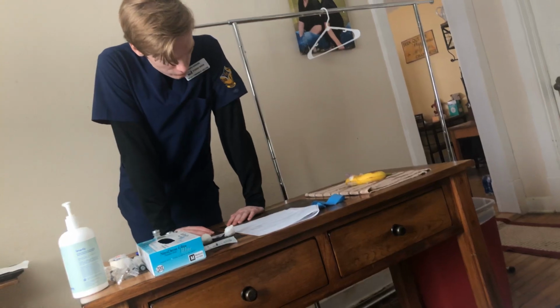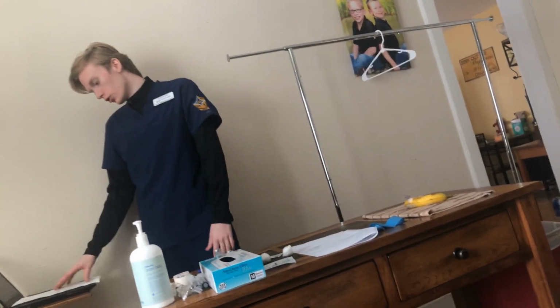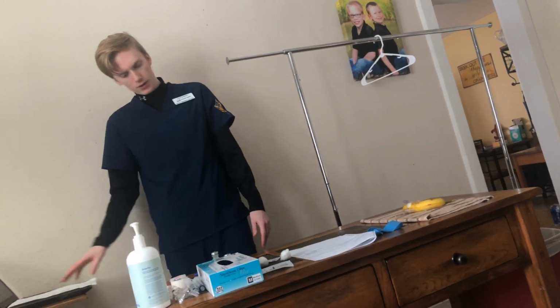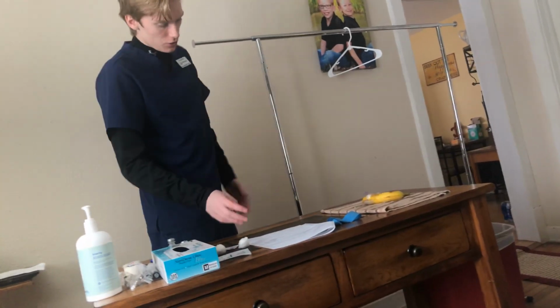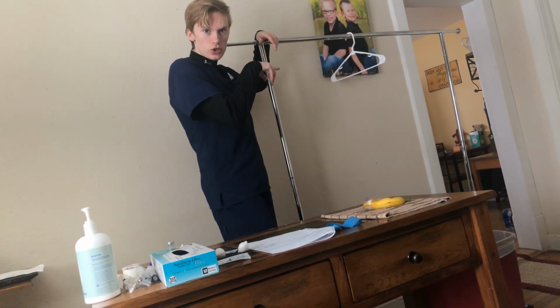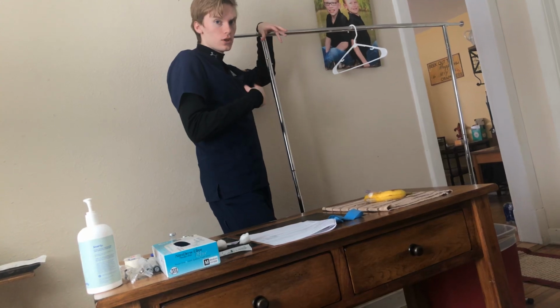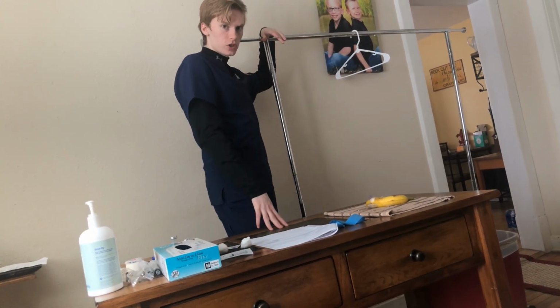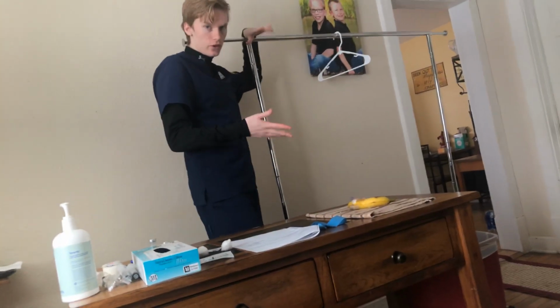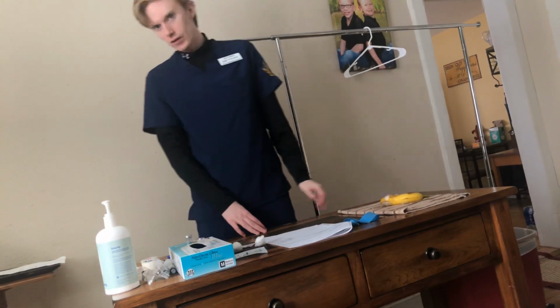Now that we have documented that, we are good to DC the catheter, the IV. Ensure that we have an order for that, in which we do, again, the 6 rights. We meet the 6 rights, and we are good to continue. Also, before I continue, when I DC the infusion, I also would have flushed 5 mils after I took out the saline, just to make sure that everything was given, there's no residual in there.